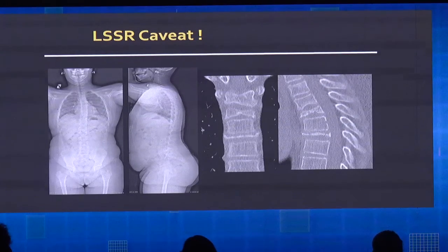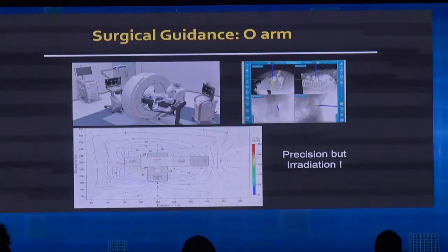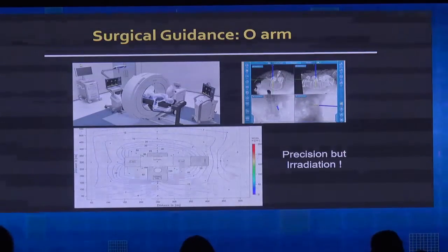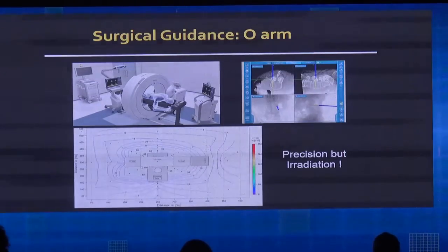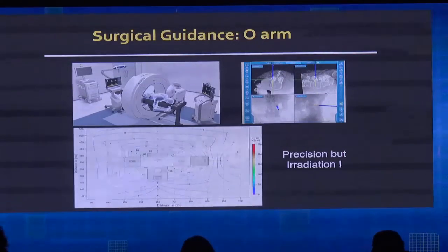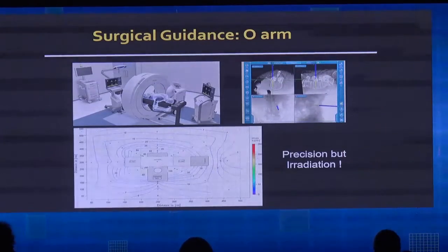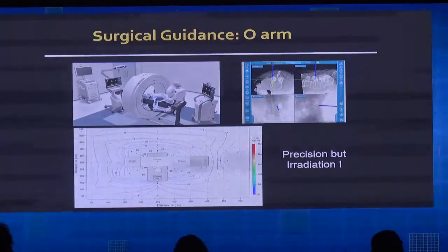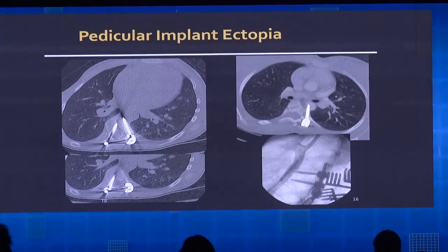So be careful. I'm going to speak about some things that we don't have, but you will understand why I'm speaking of it. It's what is called an O-arm. That means that the surgeon, when he's placing the screws in the pedicles, instead of probing with a very thin metallic wire, will in fact do a few CT slices. It's absolutely fantastic. There is a very precise guidance of the screw, but there is a big irradiation burden. Nevertheless, you remember this patient, it's sometimes probably better for the coronary and for the adrenaline of the surgeon to have absolute certainty.